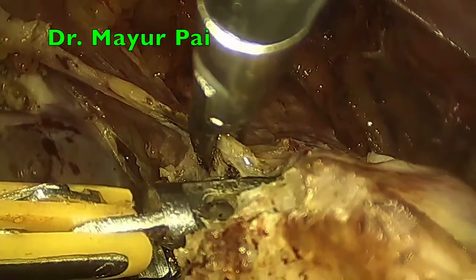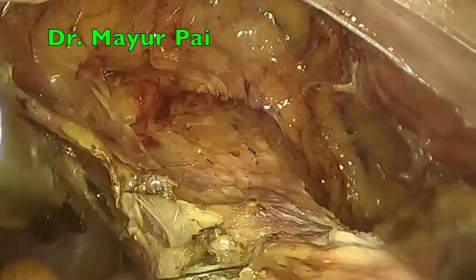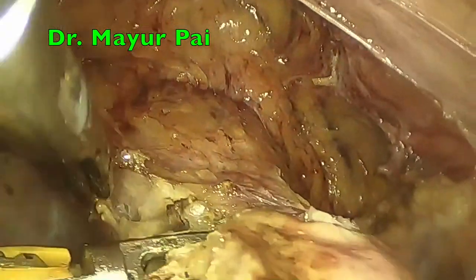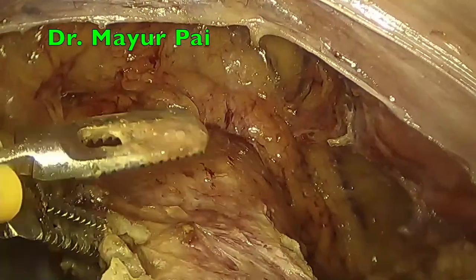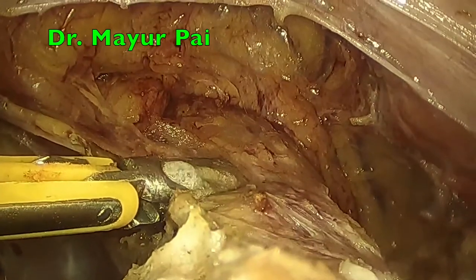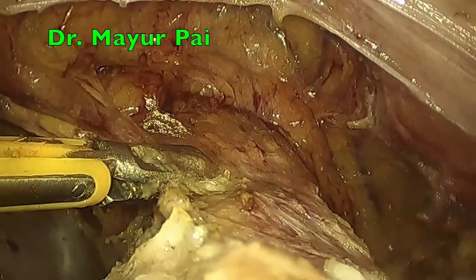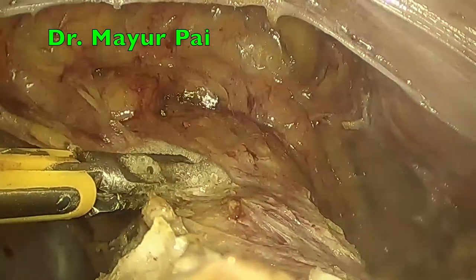Most of the patients of laparoscopic hysterectomy do not require bladder catheterization. They do not require a prolonged hospital stay and can be discharged very well between 24 to 48 hours after the case. Most of them walk in the ward or the hospital on the first post-operative day. They walk to the bathroom within 4 to 5 hours of performing the procedure. And they are mostly pain-free on the first day itself.